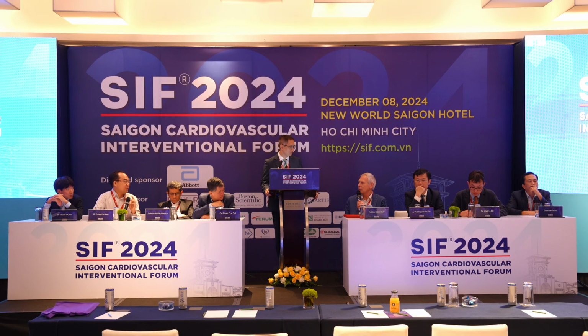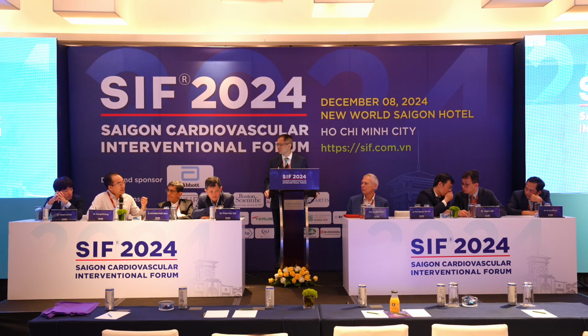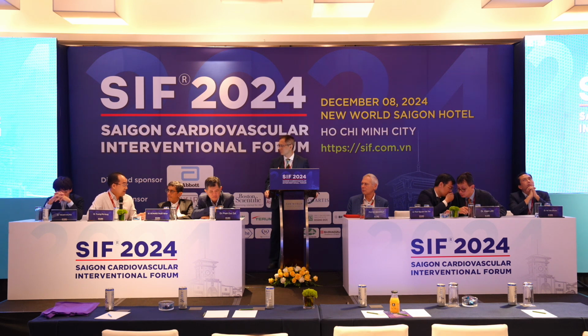You want to make a comment? Yeah, one comment quickly. I think in direct stenting, in our center now, when we get the wire through the lesion, after that we do IVUS to make sure of the diameter and everything. So in this case, you showed us direct stenting with a very big one, 4.0. So it's very big. I just worry about the distal landing zone. Also worry about dissection, also perforation. So maybe sometimes I think it's harmful.